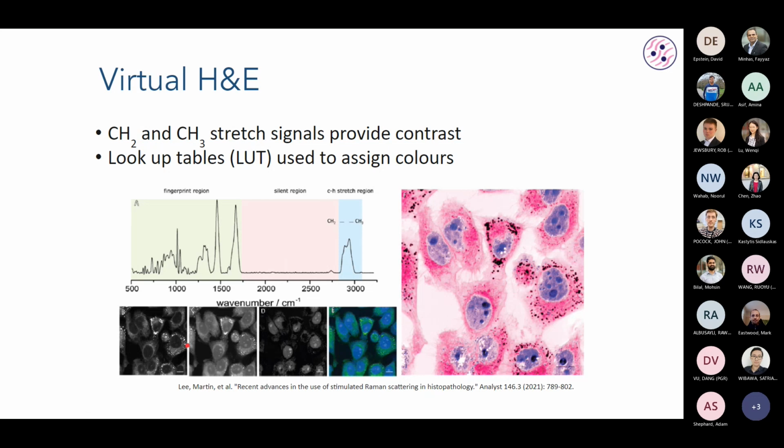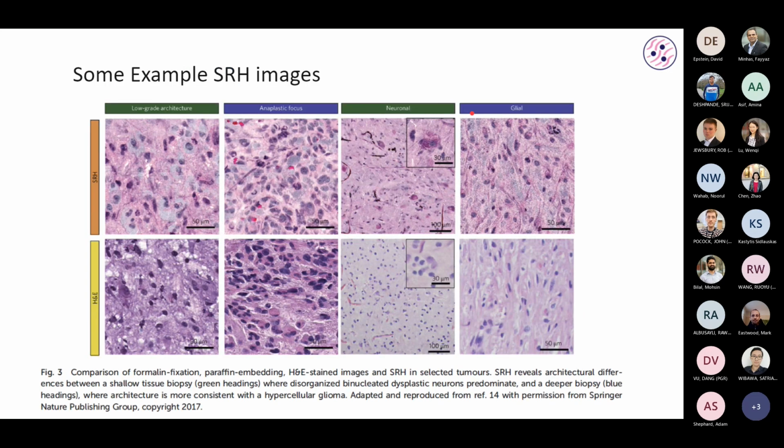How much variation would we have in the image? How much will be the variation in the false color? Because in pathology we have a staining variation problem, but for this I think perhaps we can apply more standardization.